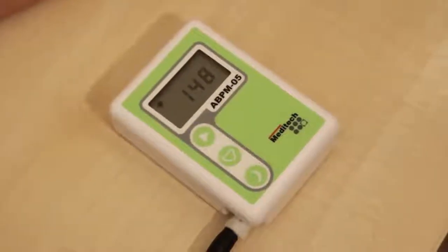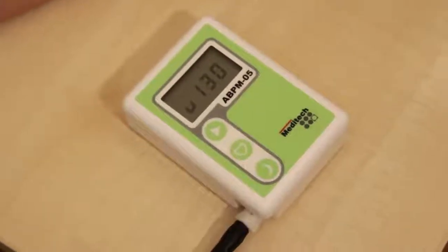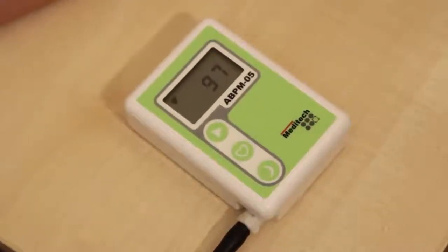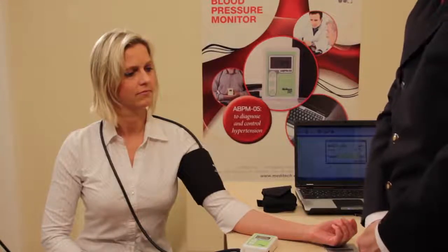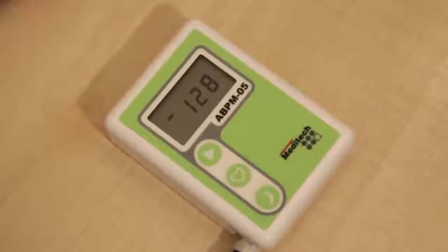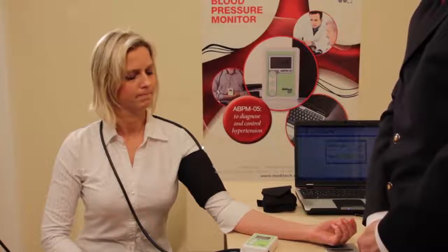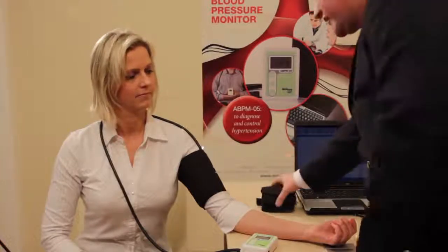After pumping up, the device will measure the blood pressure when releasing the pressure stepwise, and after the first reading is completed, it will display blood pressure, a result of the initial reading on its LCD, and also store it in its memory. This is now complete. First the systolic, then the diastolic value is displayed, followed by the pulse rate. Now we can insert the device in the pouch and apply it to the patient, like this.